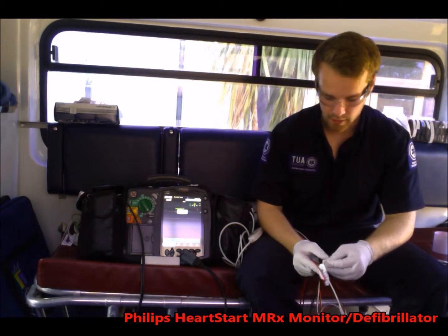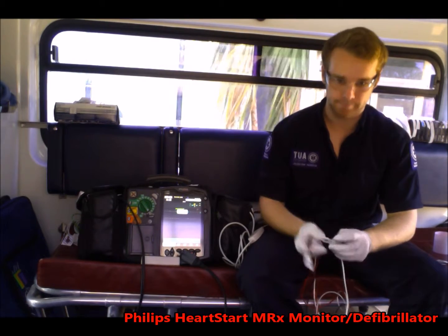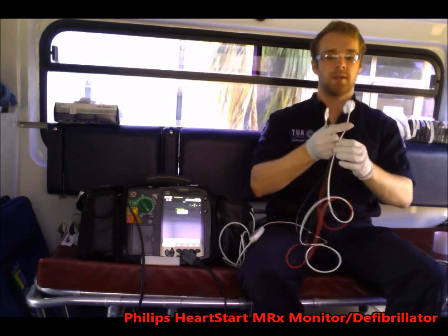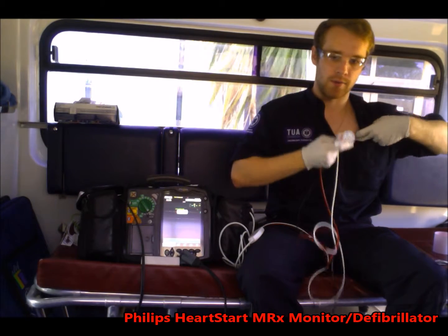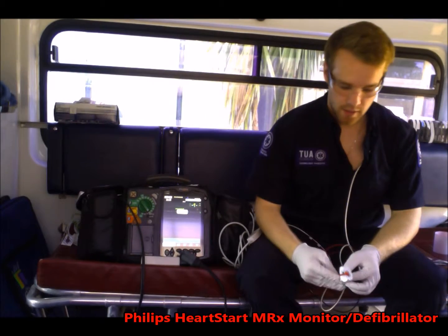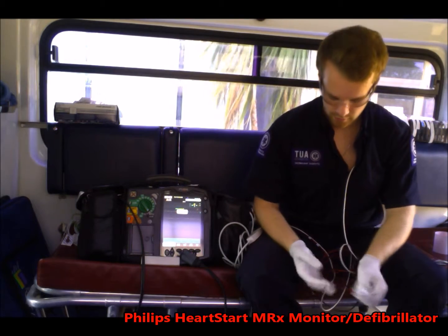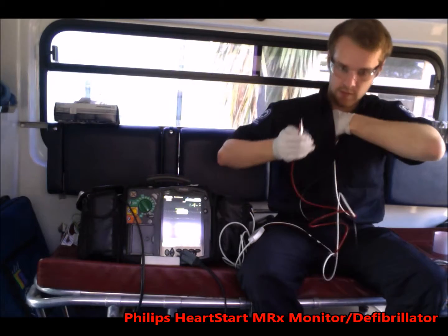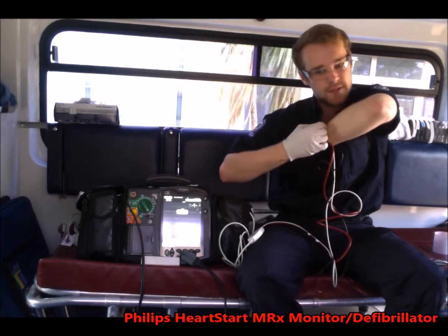So next we can apply a 3-lead ECG onto a patient, so I'm just going to use myself. So we've got 3 colours, red, white and black. The white lead goes on below the second rib on the right hand side. So there. Next is the black lead, which goes on the left hand side under the second rib. Thirdly, you have your red lead, which goes right at the bottom of the left hand side, at the bottom of the rib cage.